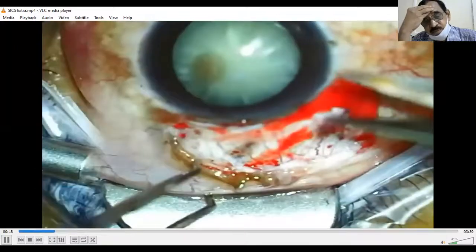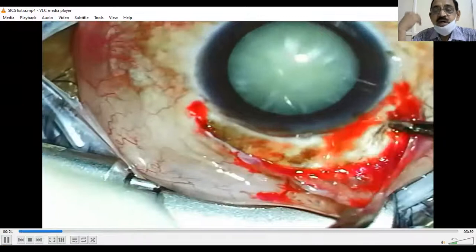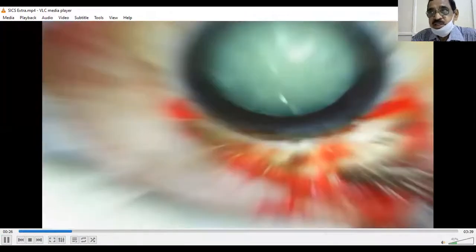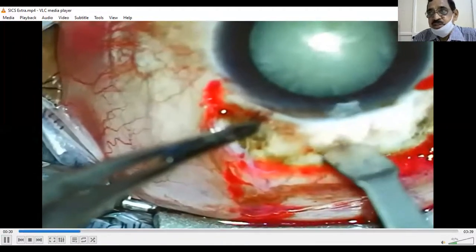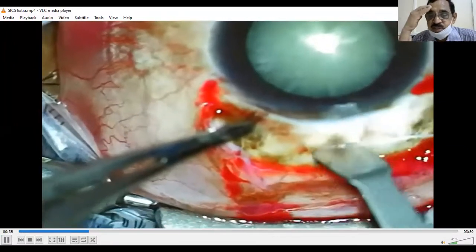Fornix-based conjunctiva. Next, electrocautery is used to obtain hemostasis. This is very important so that you have a good view while making your scleral incision. Rather than using calipers, I use the edge of the crescent blade to measure back from the limbus and then begin my frown-shaped scleral incision. This is generally about 40 to 50% depth of the sclera.